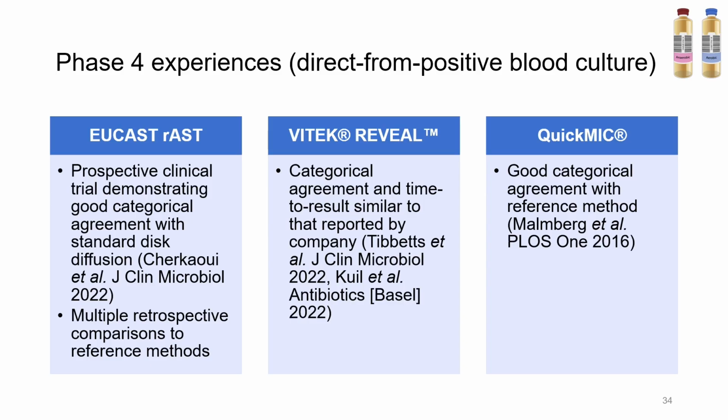So for these technologies here, basically the bottom line is we have understanding that they correspond well to reference methods, which is a good start. And then the time to result for these technologies is also pretty fast and comparable to what is stated by the manufacturer.